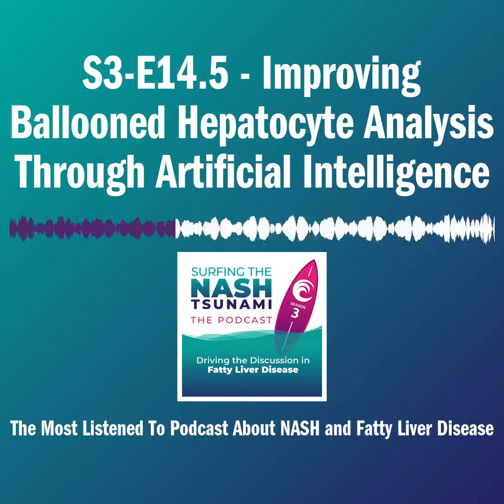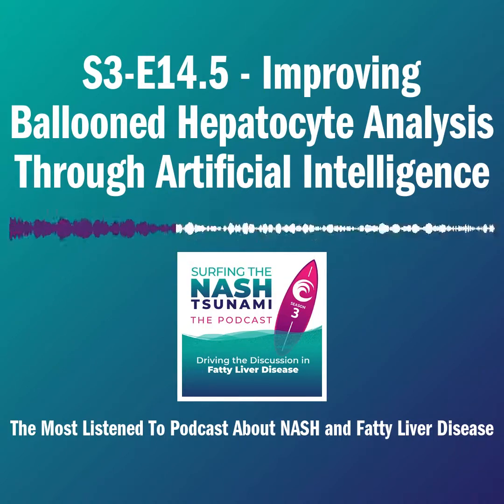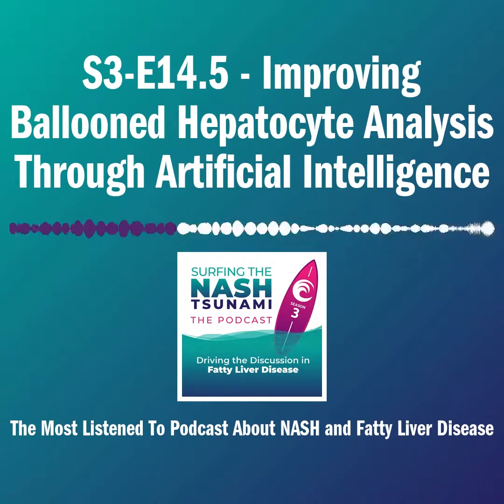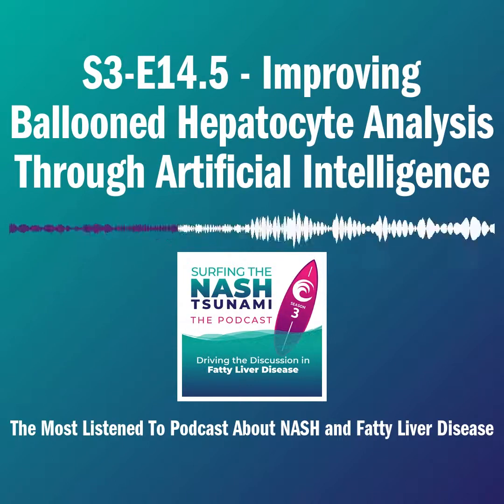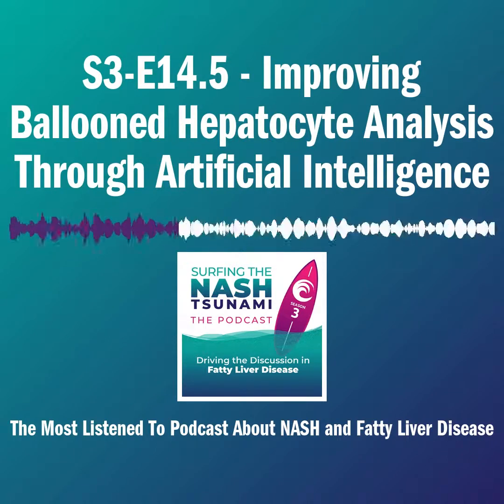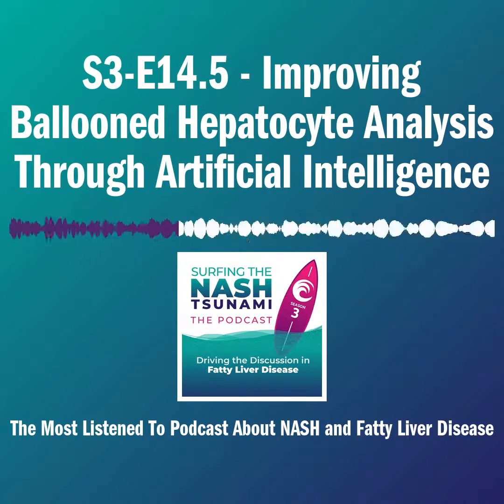And so we selected a midpoint in the paper, a concordance of 5 pathologists, because it was a useful point for discussion. The reality is that what we've observed in this phenomenon allows you to tune the algorithm and dial its sensitivity and specificity up or down according to the question you want to ask.